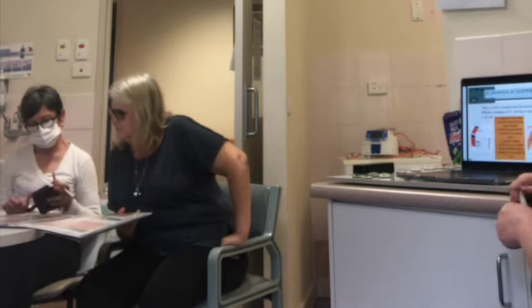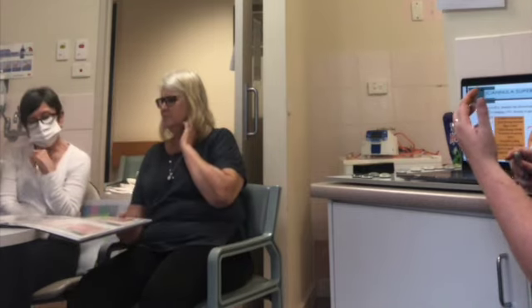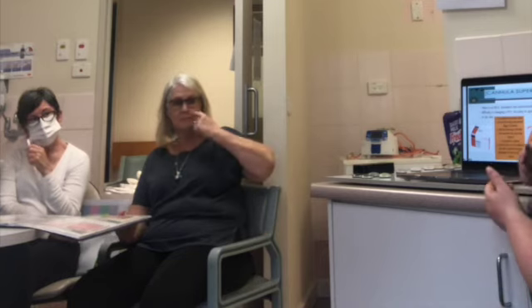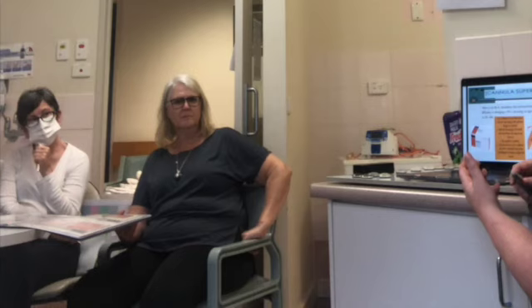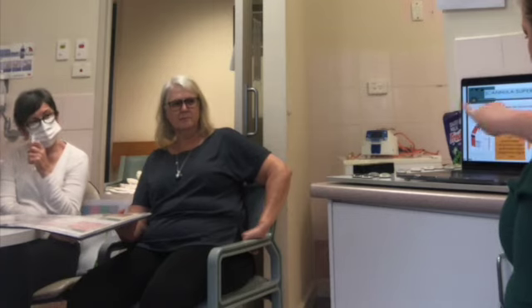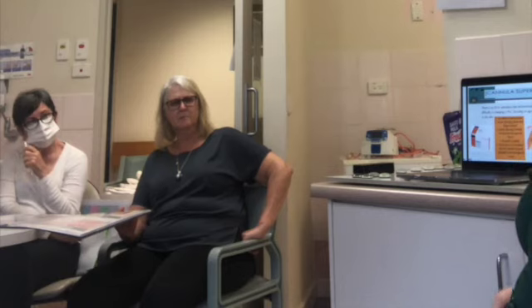There's nothing I can show you in here in a simulation that's really going to reflect how difficult it is to change a cannula on a little old lady with fragile skin, dry skin, or patients that are anticoagulated or on steroids long term. If it's moist, it's tricky. I think we used to have the Smith and Nephew anti-adhesive swab. In ED I'm seeing some of this brand of anti-adhesive swab. It's always a good idea to have some of those on your cannula trolley.